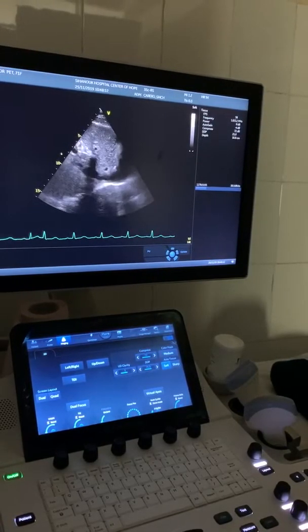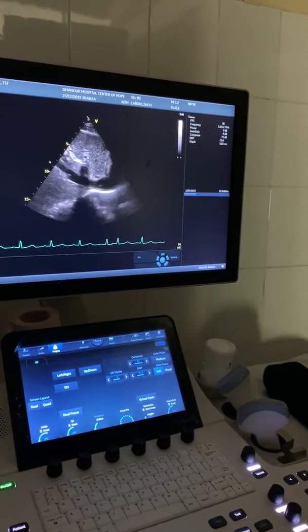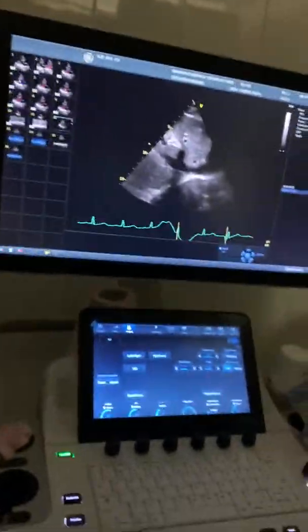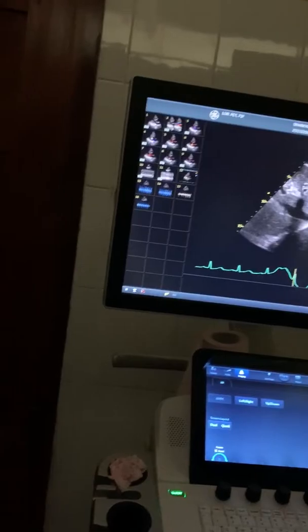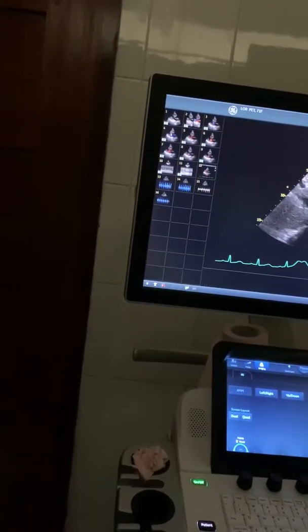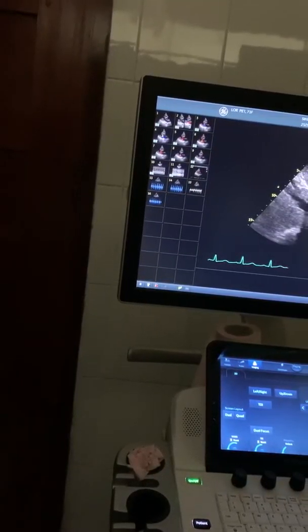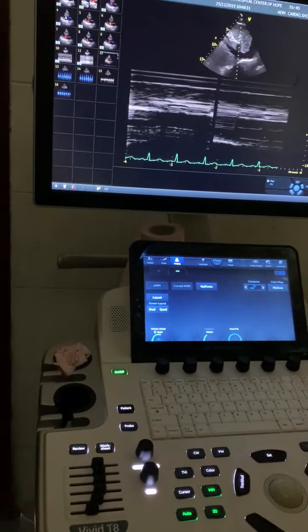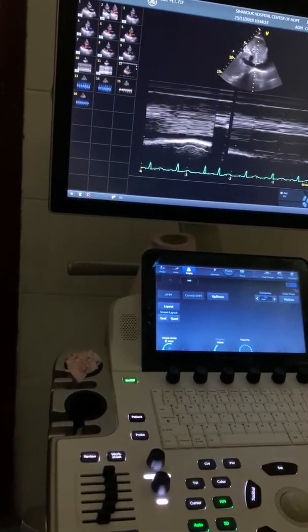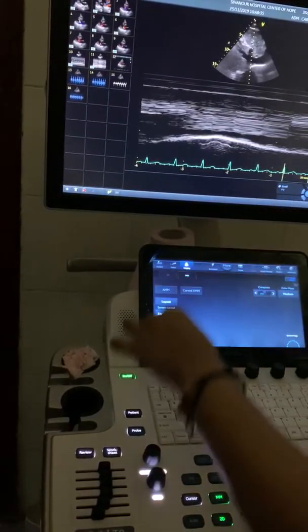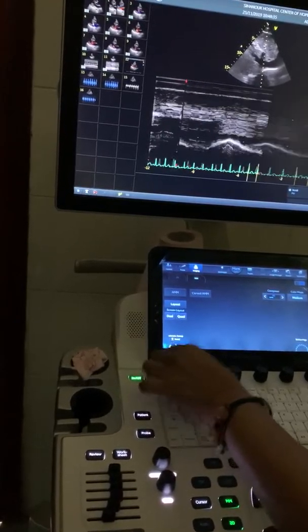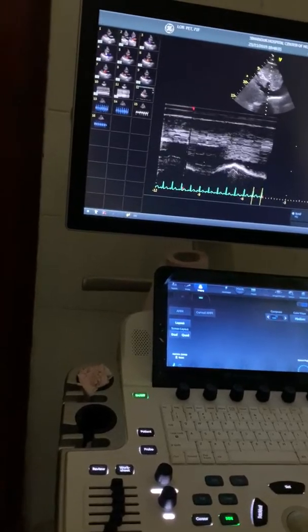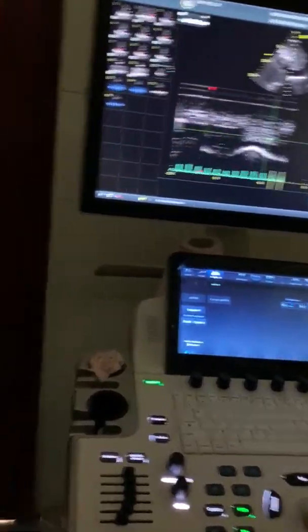Just a slur, only rotate. I don't even have to ask her to breathe in - it's normal. Usually you measure only with the caliper, only like that. You can go to the M-mode. From here I know she's got already inspiration and expiration - normal, it collapses. And then we use the caliper to measure. Caliper is very simple.